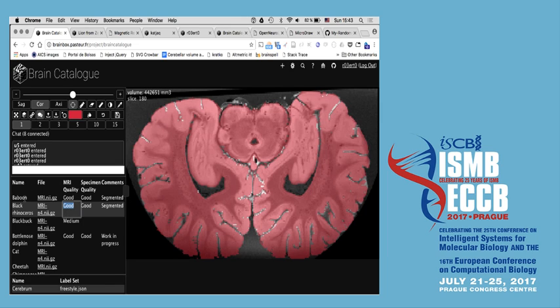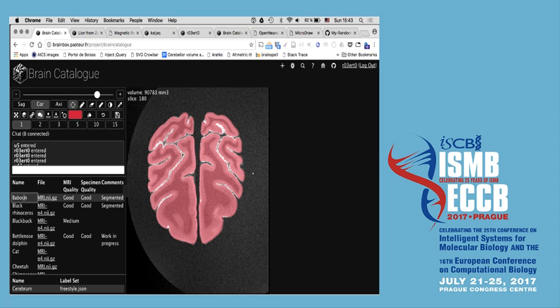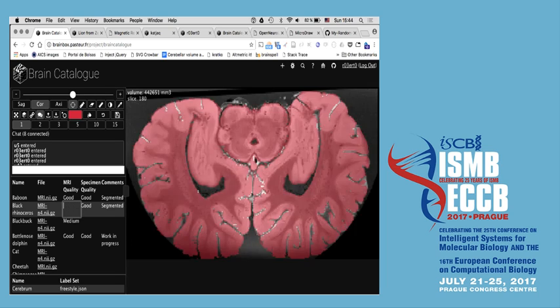So that's a black rhinoceros, but I will probably move to the baboon, who has a smaller brain than a black rhinoceros. This may probably be the only black rhinoceros sitting on the web. It's quite cool. So of course I can come here myself and annotate. Let's say that I think the black rhinoceros quality is not actually good, but medium, or that the specimen has some damage.